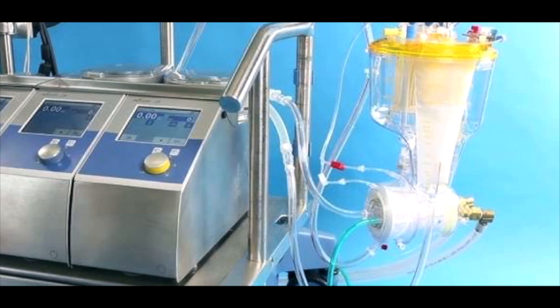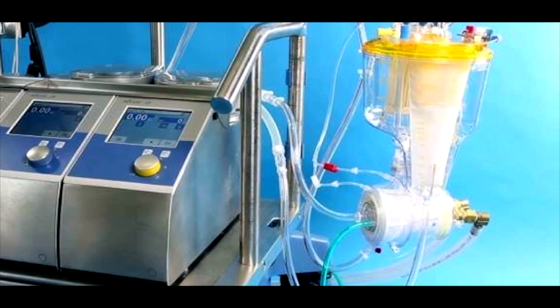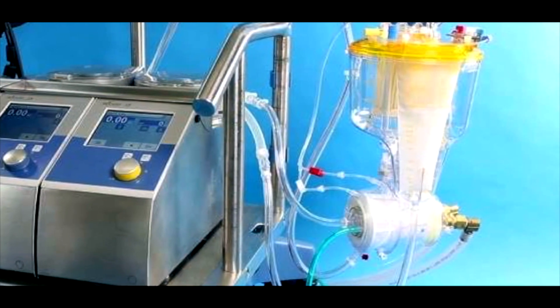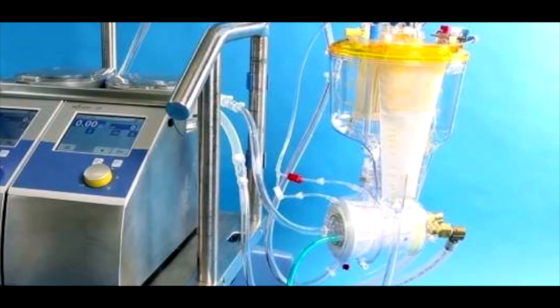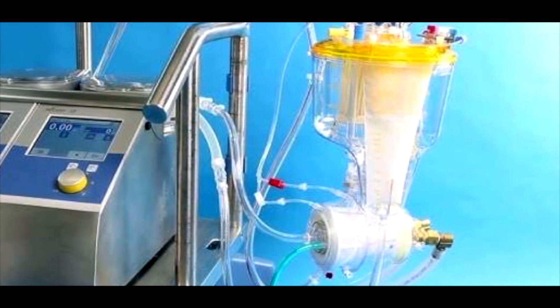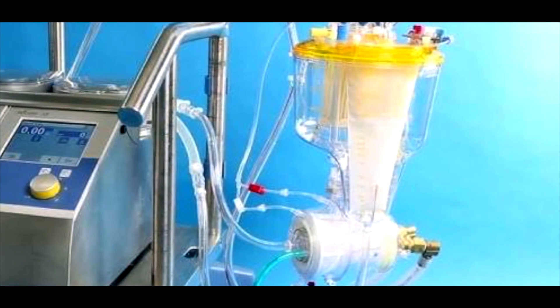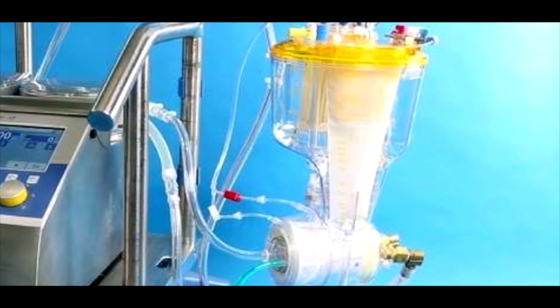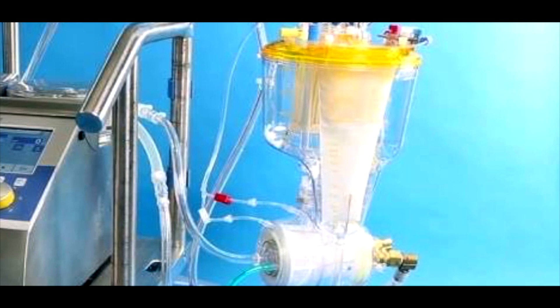Hello guys, welcome back to my YouTube channel. My name is Stefan and I am working as a clinical perfusionist since the last 13 years. Today I am coming with a different topic: the oxygenator components in detail of the Inspire oxygenator, which belongs to the Sorin company. This oxygenator is one of the best and easy to handle in case of emergency and also in crash patients. Now I am going to explain you in detail the parts of the oxygenator.